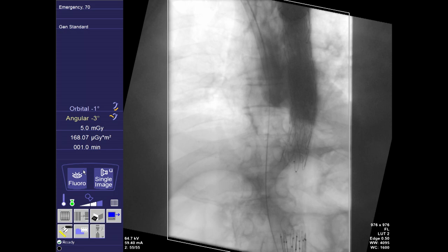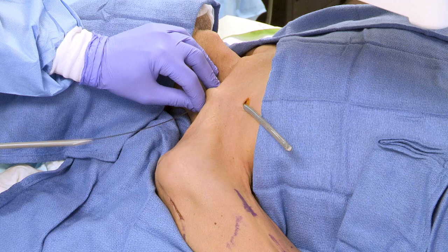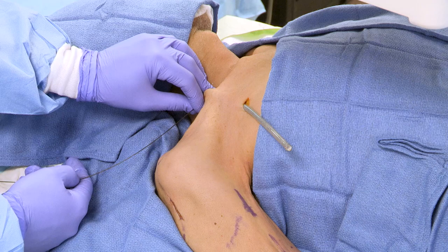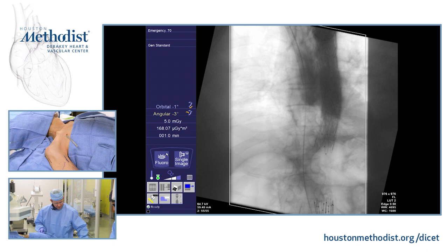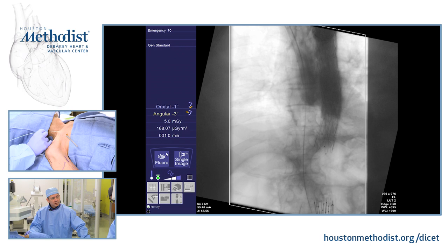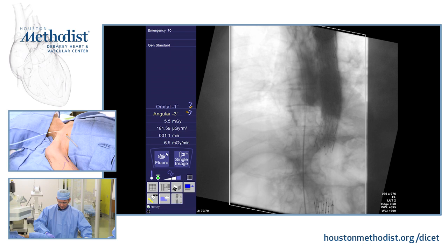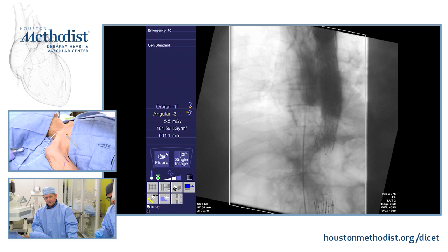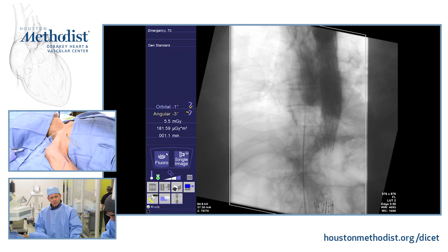At this point we'll switch out for a stiffer wire, typically an Amplatz wire. We'll take out the indwelling portion of the catheter and use a diagnostic catheter such as a Berenstein. We'll pass the diagnostic catheter over the previously placed wire down into the inferior vena cava and get a stiffer wire. That's really the key portion of this case — having a stiff wire in the inferior vena cava. If you have that, then you can do this procedure safely.